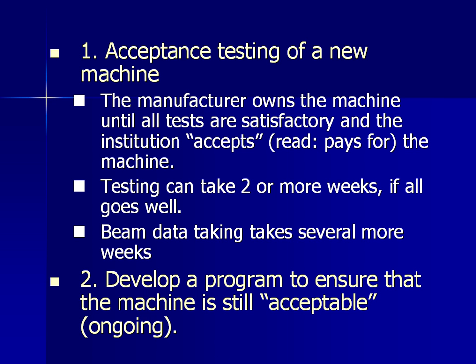Certainly, if we're doing our annual quality assurance, if any value seems out of line, we would naturally raise a flag on that. But say a TG51 calibration on an annual check, I don't know what kind of redundancy we have on that. Other than that, we have RPC TLDs every year. Yeah. Right.